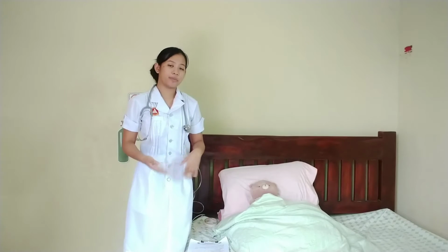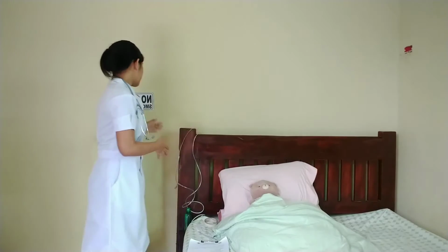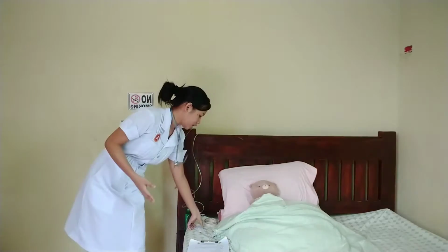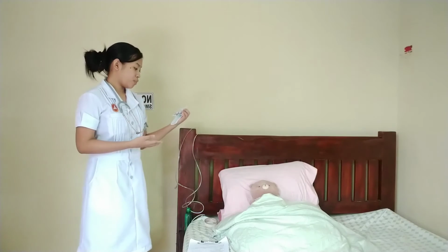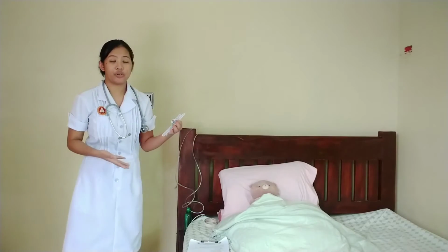After assessment, I will now do the planning, in which I will be preparing and assembling all the equipment I will be needing. So I will need an oxygen tank with a flow meter and an adapter, and also a humidifier bottle, with distilled water or tap water depending on the doctor's order or the agency rules.